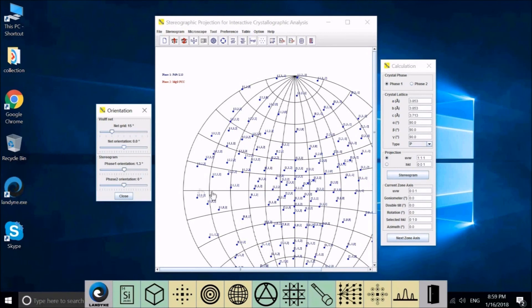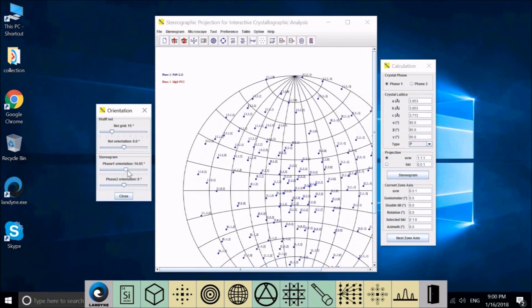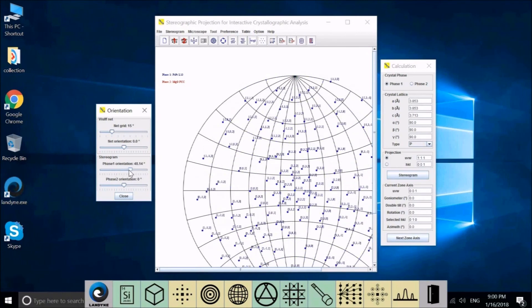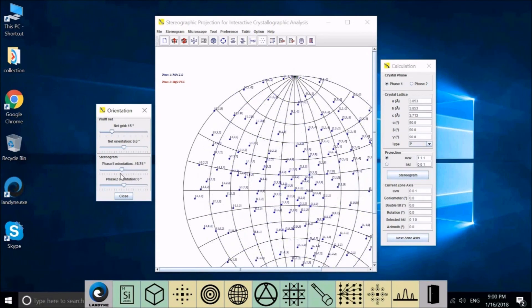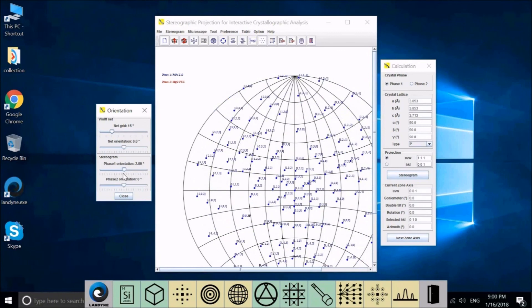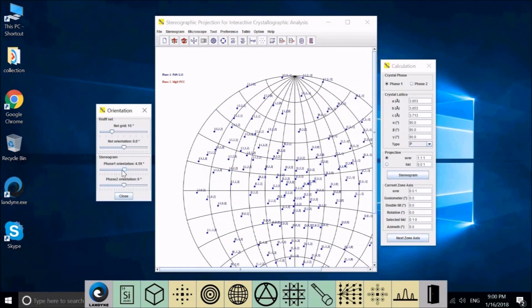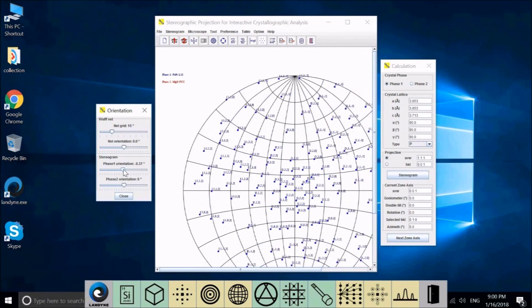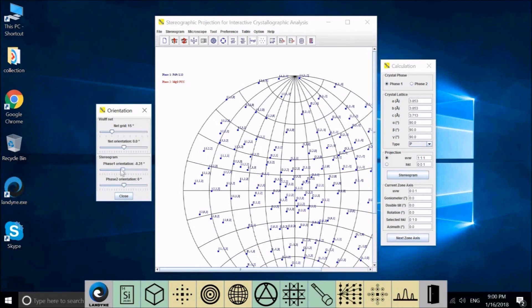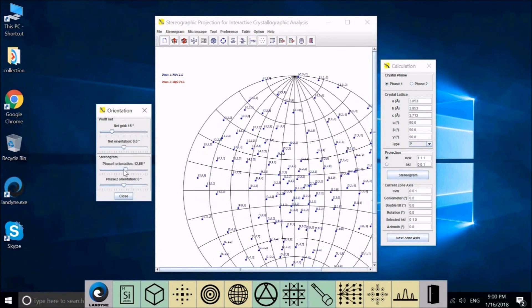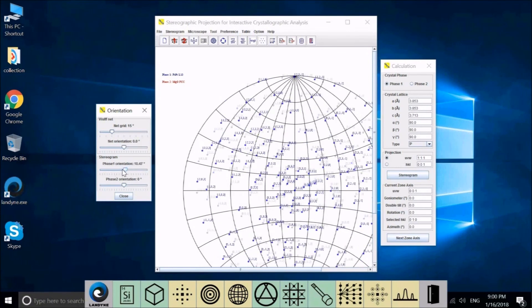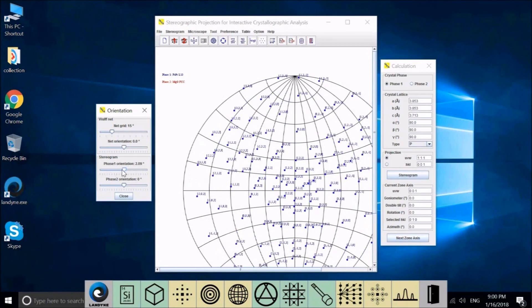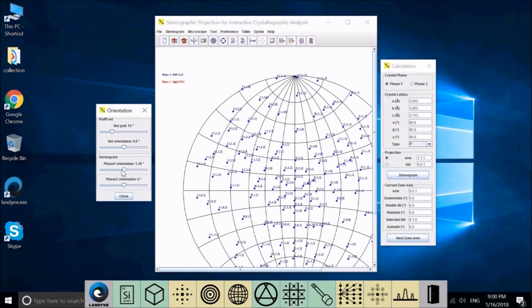You can also rotate the stereogram of phase 1 or phase 2. This stereogram is for phase 1. Keep the central here. And the whole stereogram is changed. And you can use the keyboard to precisely adjust the orientation of the stereogram. Let's set back to zero.